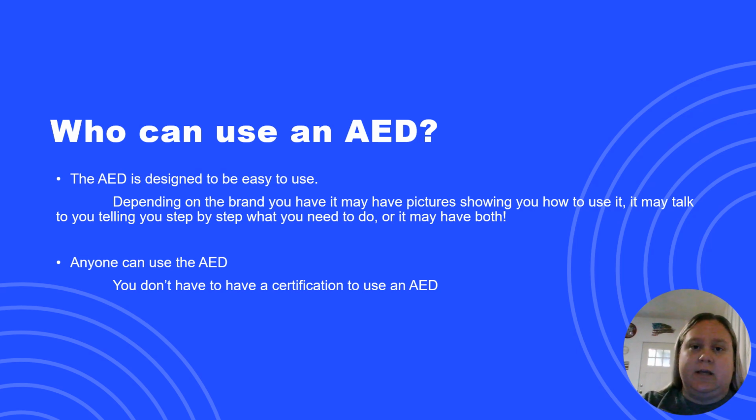You can literally be at the grocery store and have a job in construction and have never touched an AED in a day in your life, and grab an AED that they have there at the grocery store and be able to put it on somebody. They're that easy to use.